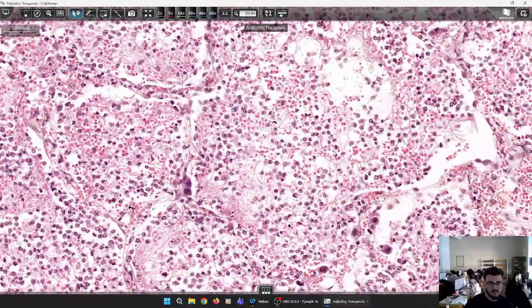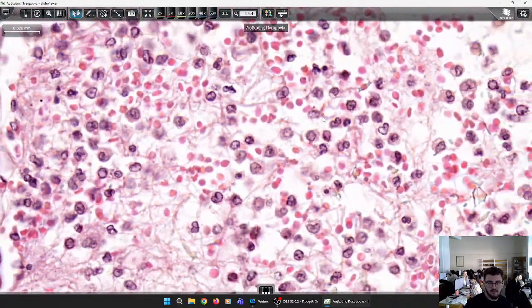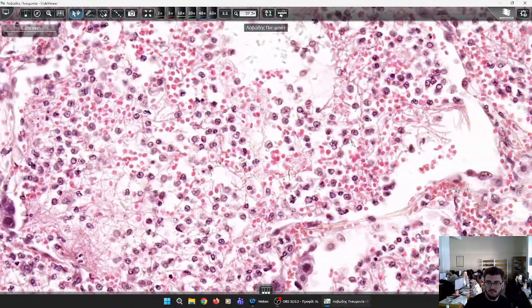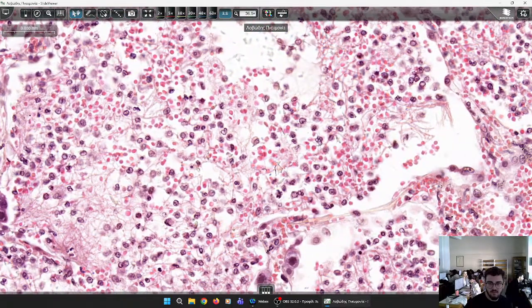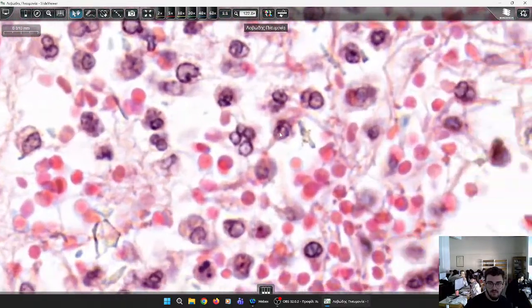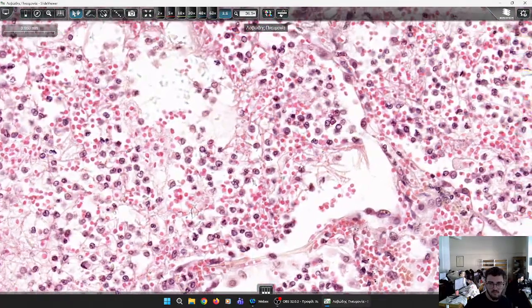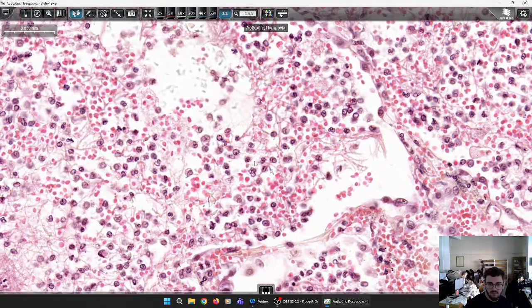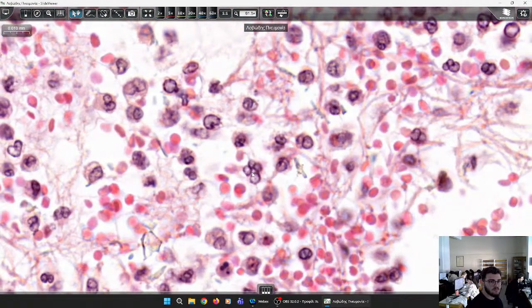Yeah, please. I wanted to ask, can this tell us also the days? For example, since there is fibrin, it's been one week since the... The chronicity, no. If you see neutrophils, that means acute inflammation. If you see mononuclear cell infiltrate apart from macrophages, that means lymphocytes, this is chronicity.